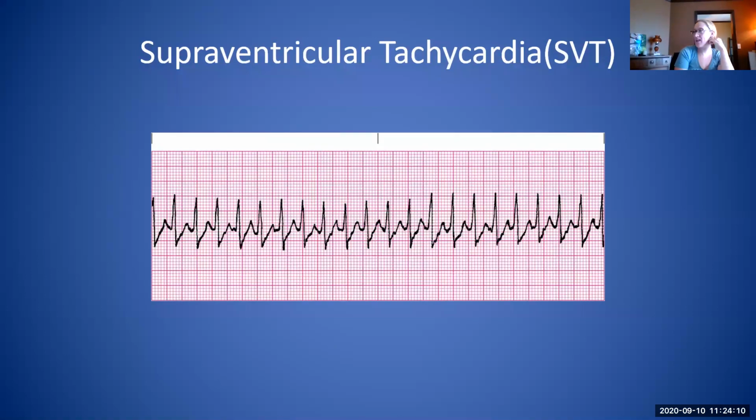So you just give that medication rapidly, tell your patient that you're getting ready to give it so you can warn them. And you also want to warn the CMC, if you're at a facility that has a central monitoring station, you want to let them know too. So that way they're not calling a code overhead when they see a patient go asystole like that.